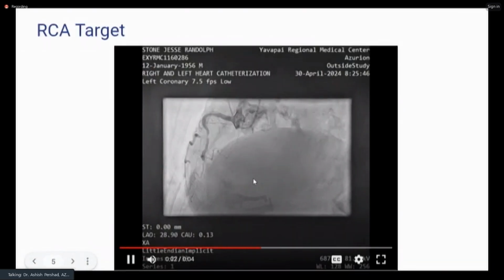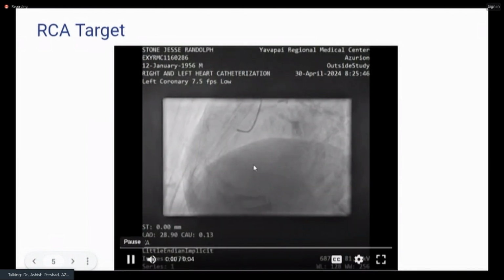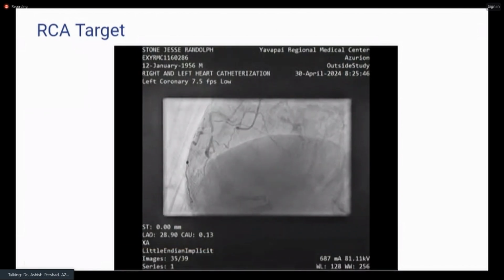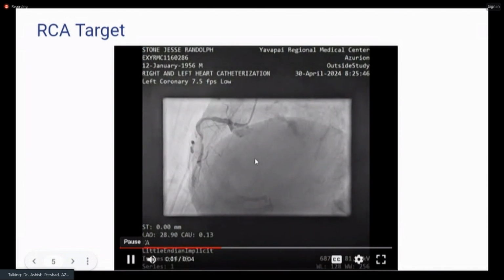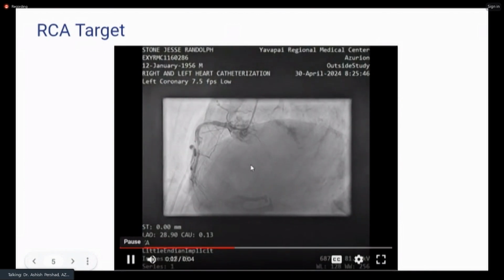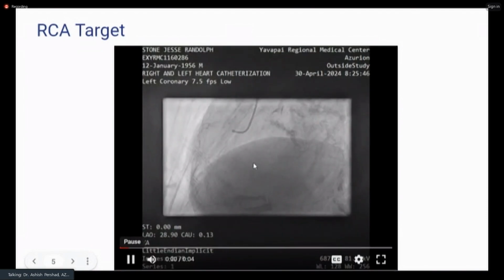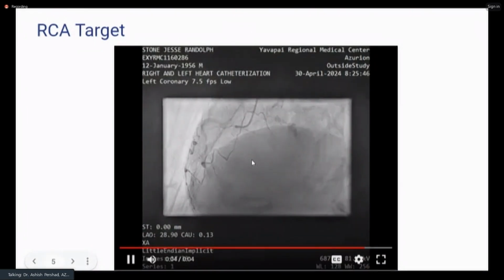And this was the image of the right. It's a codominant right coronary with a pretty decent sized PDA, heavily calcified. Not really a shepherd's crook, but a pretty decent angulation pointing up, and then some diffuse proximal disease, mid-segment occlusion right after the marginal, and then maybe a 30-40 millimeter occlusion, at least based on that image, that fills the distal PDA and a relatively small PL segment.